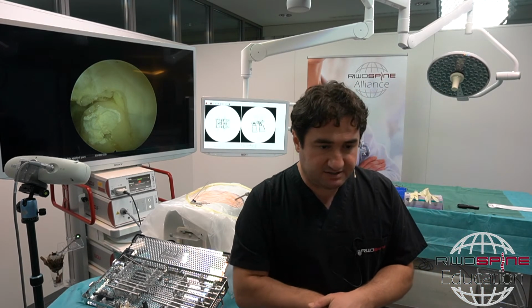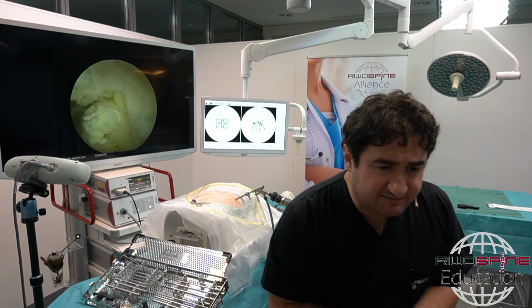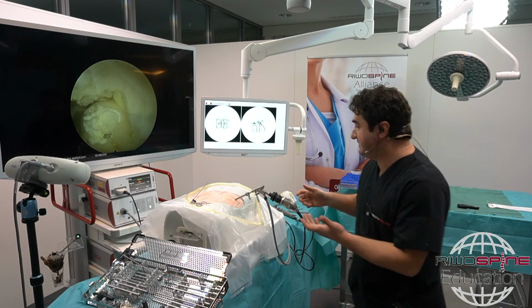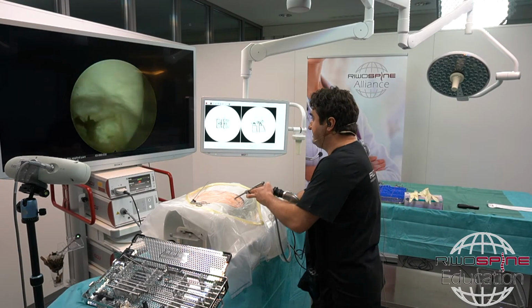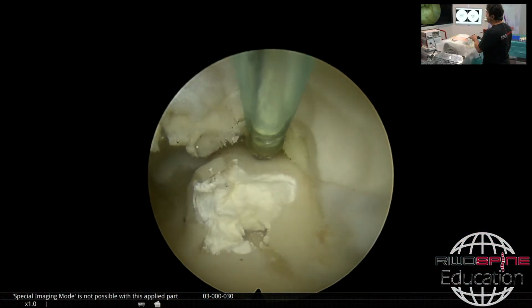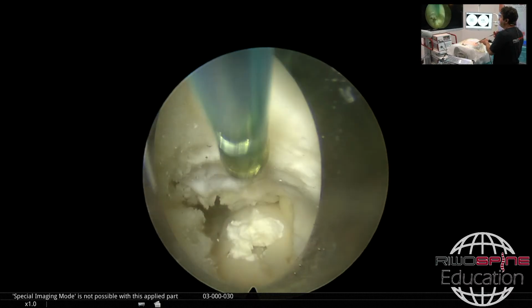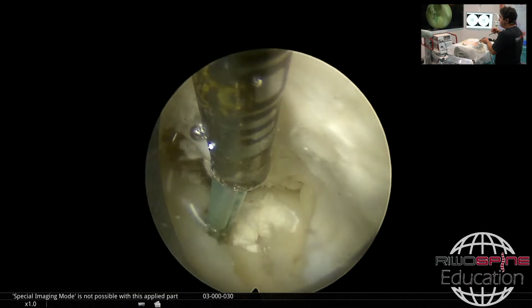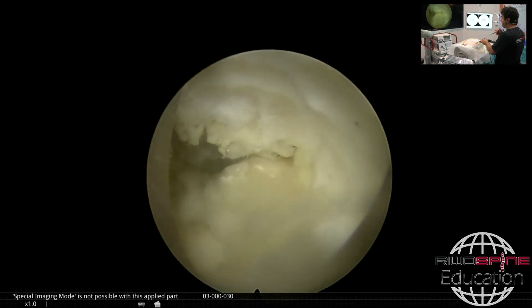Okay, another question. Do we have another question? Okay, Professor Yusuf. In extraforaminal cases, do we need drilling? 99% we don't need, because I can demonstrate it on the model again. Here, you need the drilling to reach the spinal canal. Yeah, but in the extraforaminal area, you are already outside of the foramen, and you don't need to resect the bony structures here. Okay, maybe.